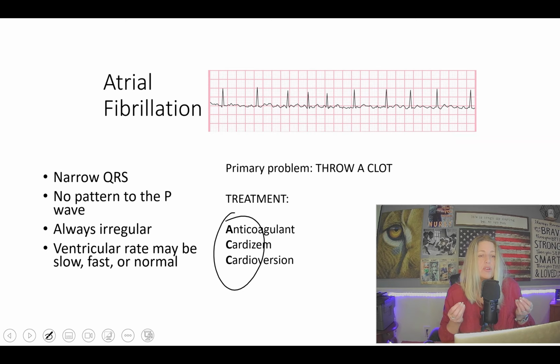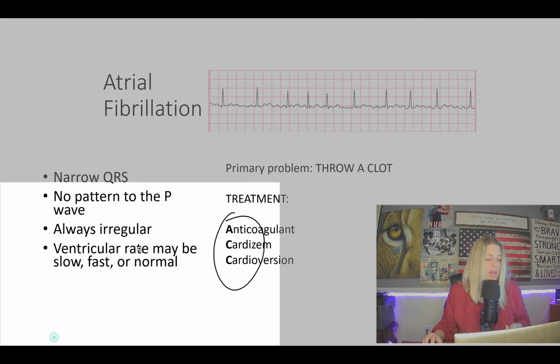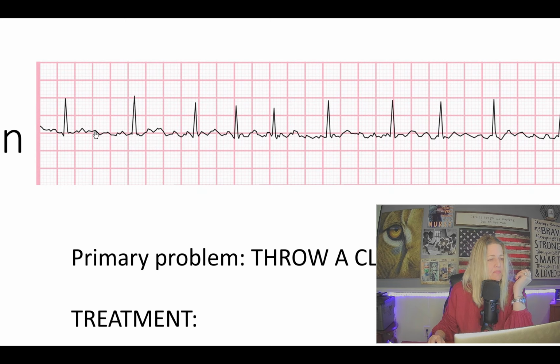But there's no pattern to the P wave. So do you notice how there are so many P waves, it's hard to even tell? And what we have a tendency to do is go, well, I see P waves there. This could be a P wave. This could be a P wave. Look at all these P waves here. Sharon, there are P waves, you're right. There are P waves. But there's no pattern to them.